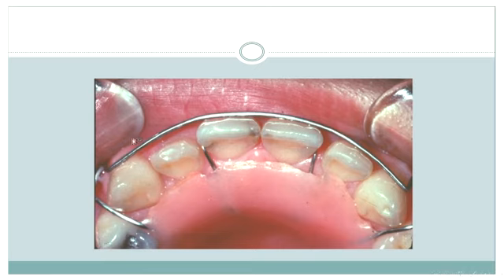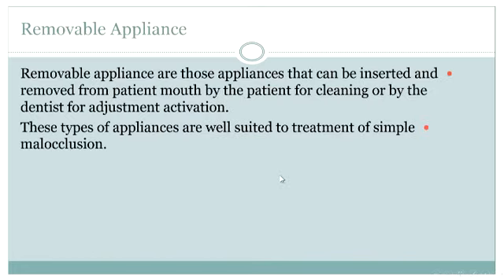Sometimes a wire, like a labial arch wire, is also used for stabilization, and sometimes we need to apply a slight pressure on the teeth if recommended or needed.